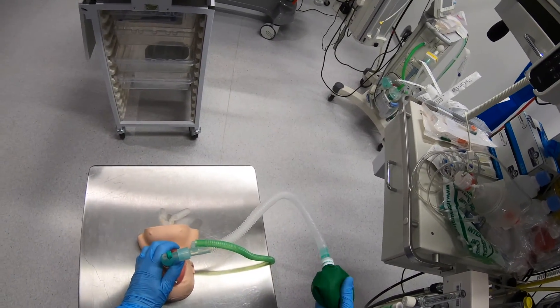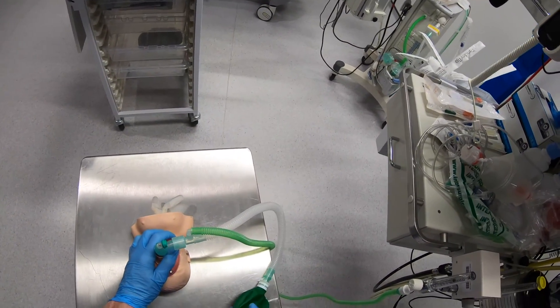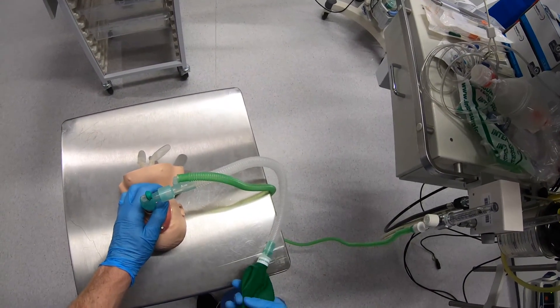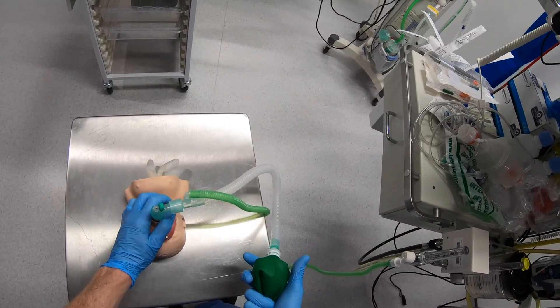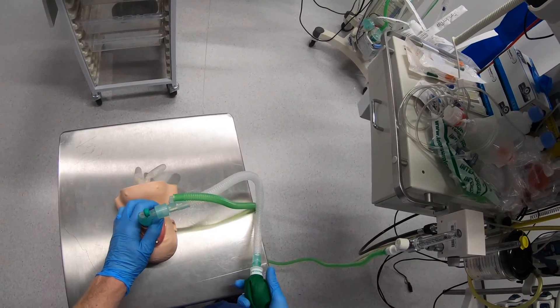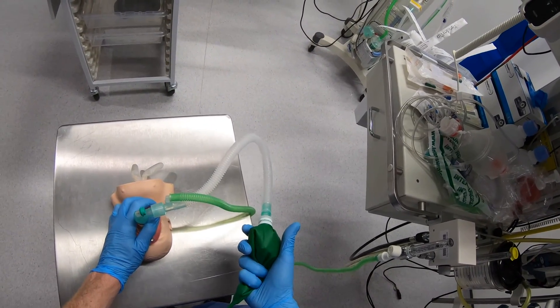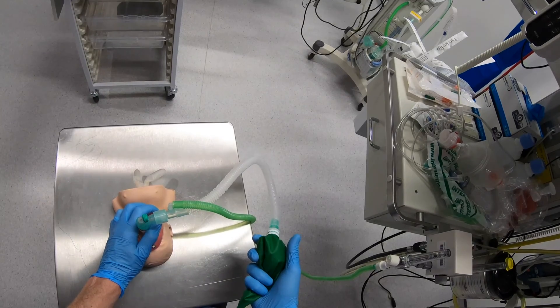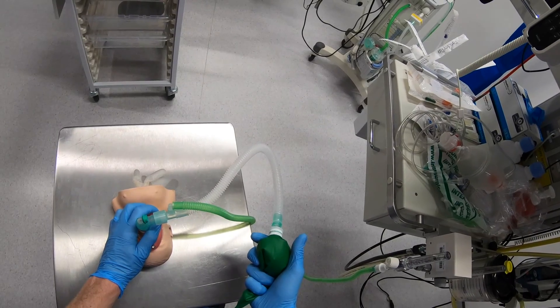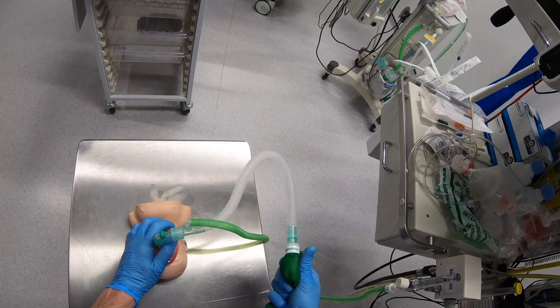I can also squeeze the bag to deliver positive pressure ventilation to the patient. I'm occluding the back of the bag with these two fingers. Because this is a small patient I'm holding the bag quite far up because I don't need an awful lot of tidal volume. These fingers on the bag are controlling my PEEP — if I relax them the bag collapses more, if I squeeze them down the bag tightens up. This is how I control how much PEEP I'm giving and how much ventilation depends on how hard I squeeze the bag.